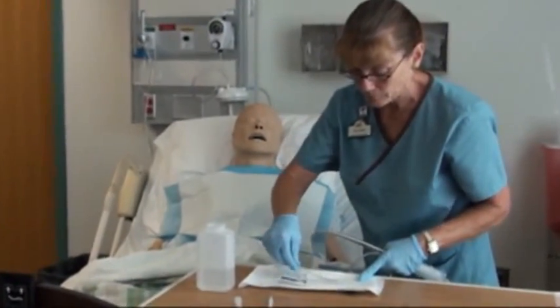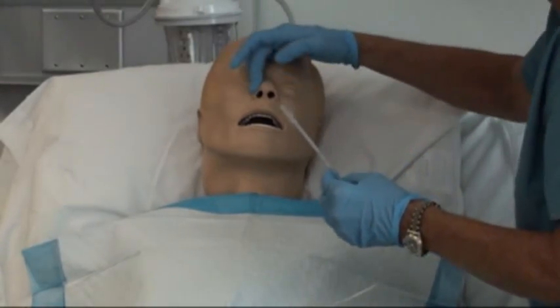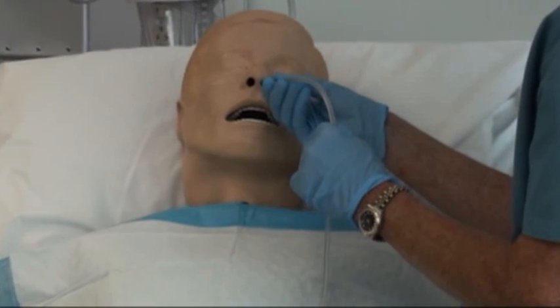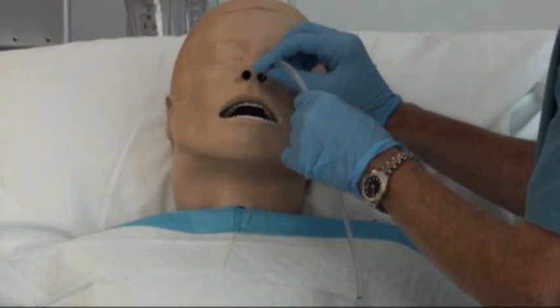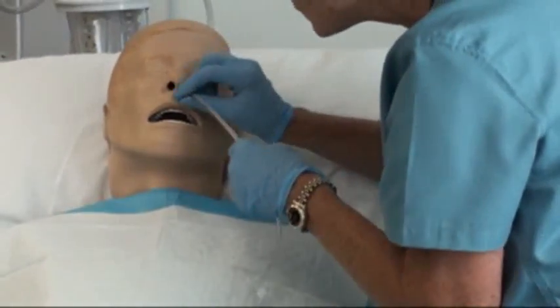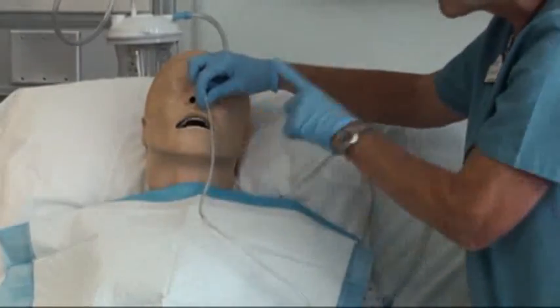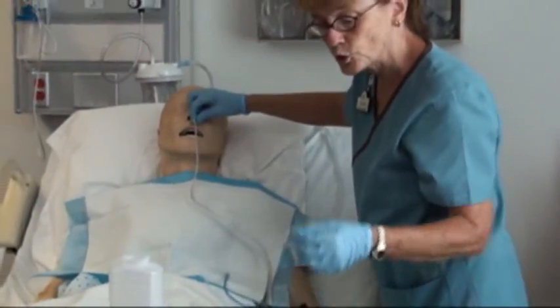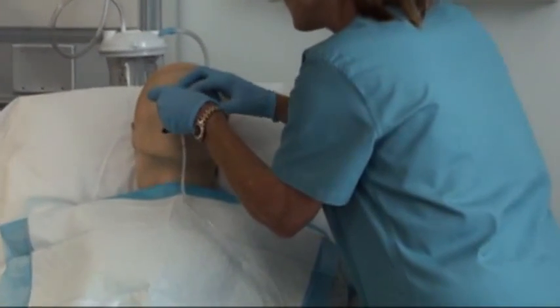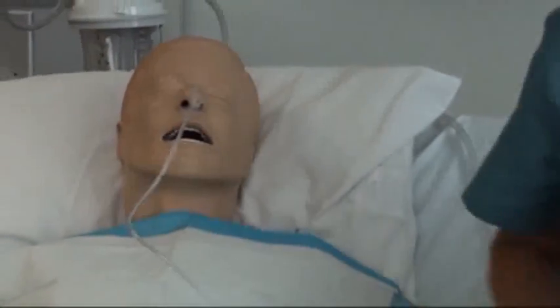Lubricate the tubing. Have the patient breathe out to determine which nostril is more open and has less obstruction. When inserting, the tube initially goes up, then tilts down when it reaches the back of the nose. When you hit the gag reflex — you'll feel it and the patient may gag — have them start sipping water. Each time they swallow, advance the tube. Once it's in, don't let go or it will fall back out. Apply a temporary piece of tape to the nose to anchor it.